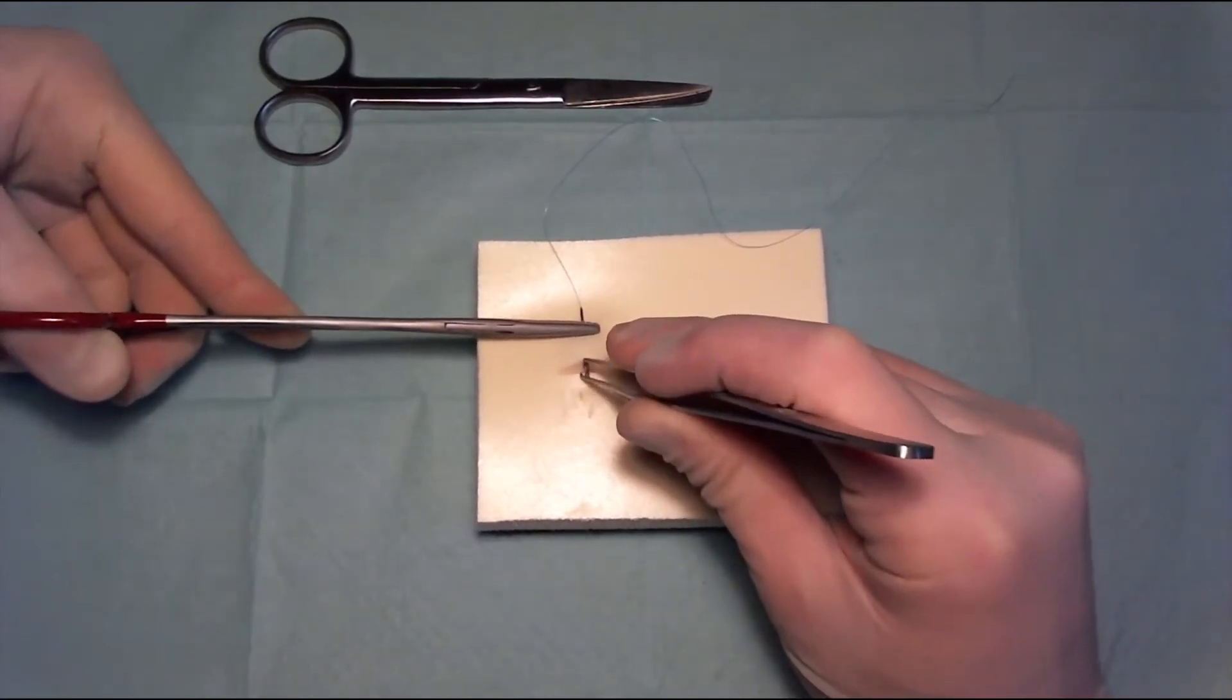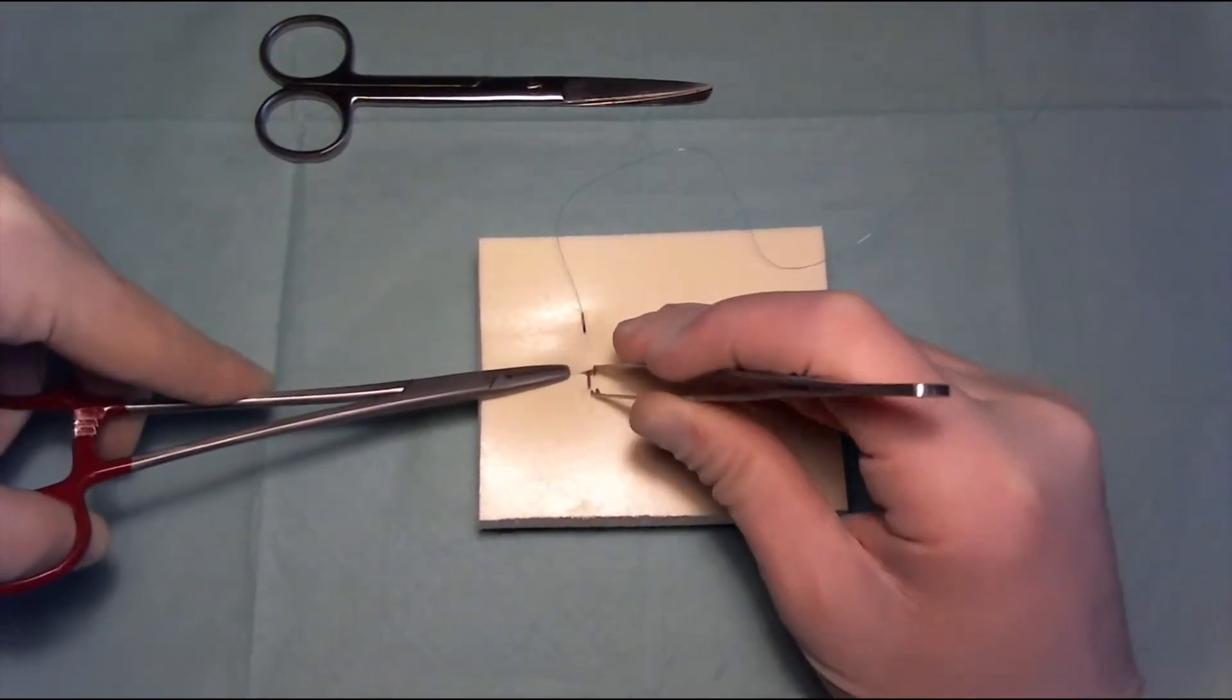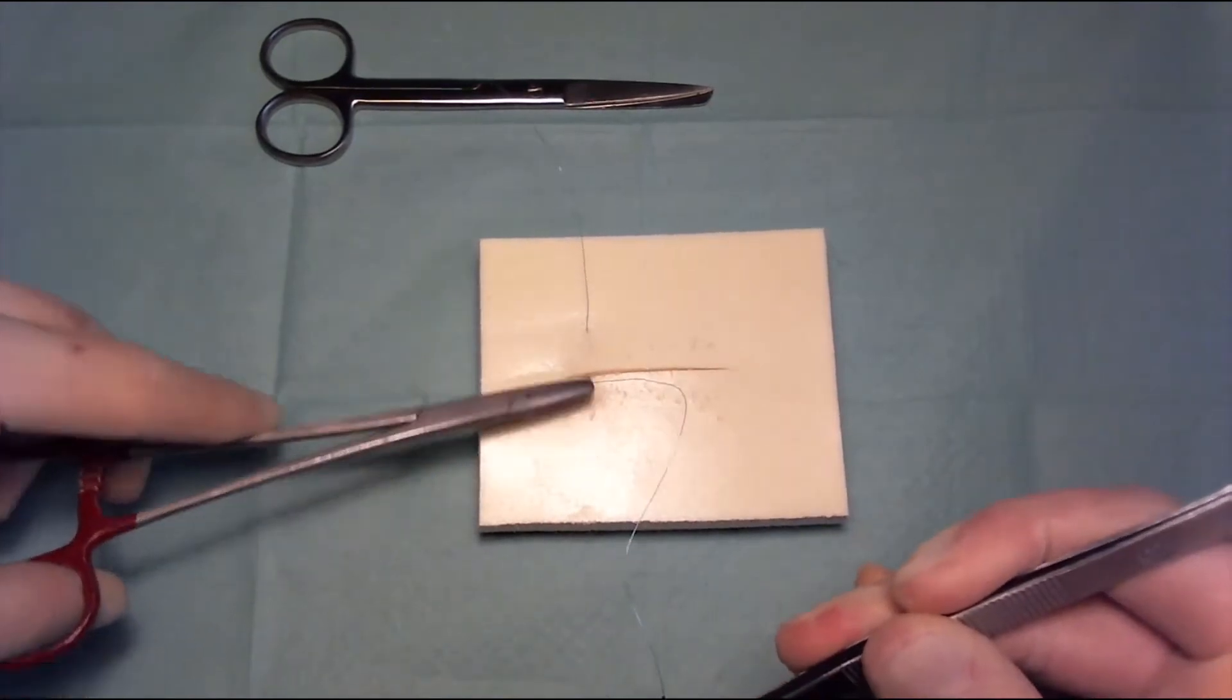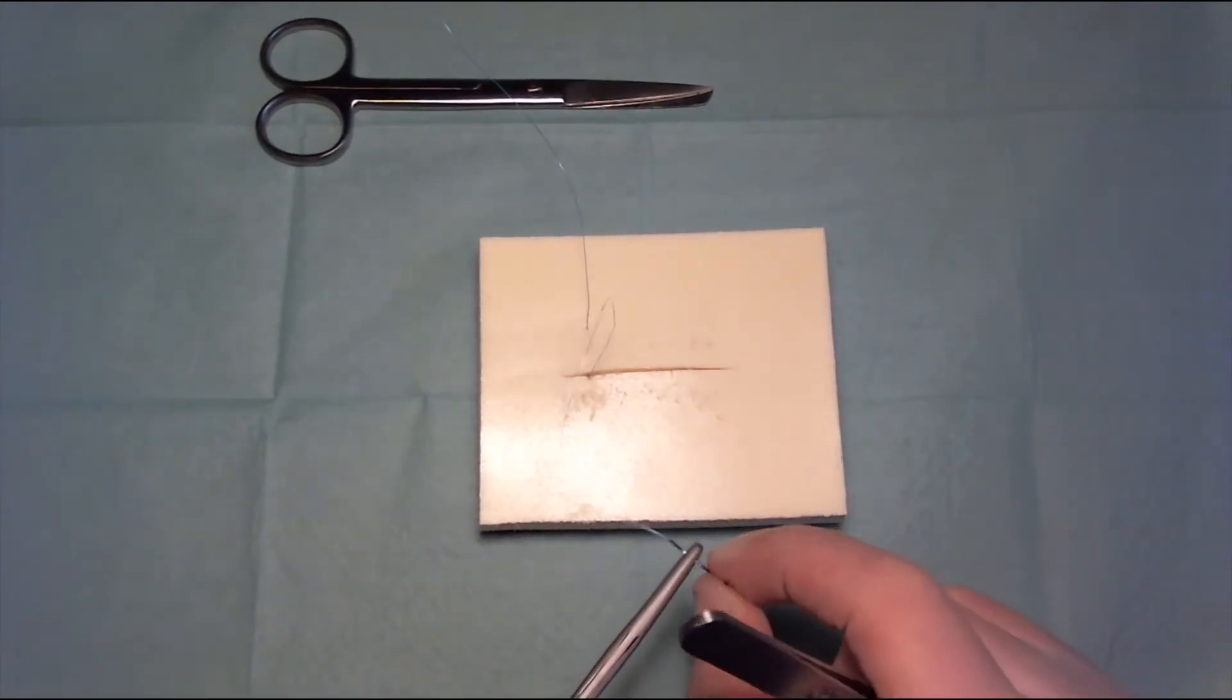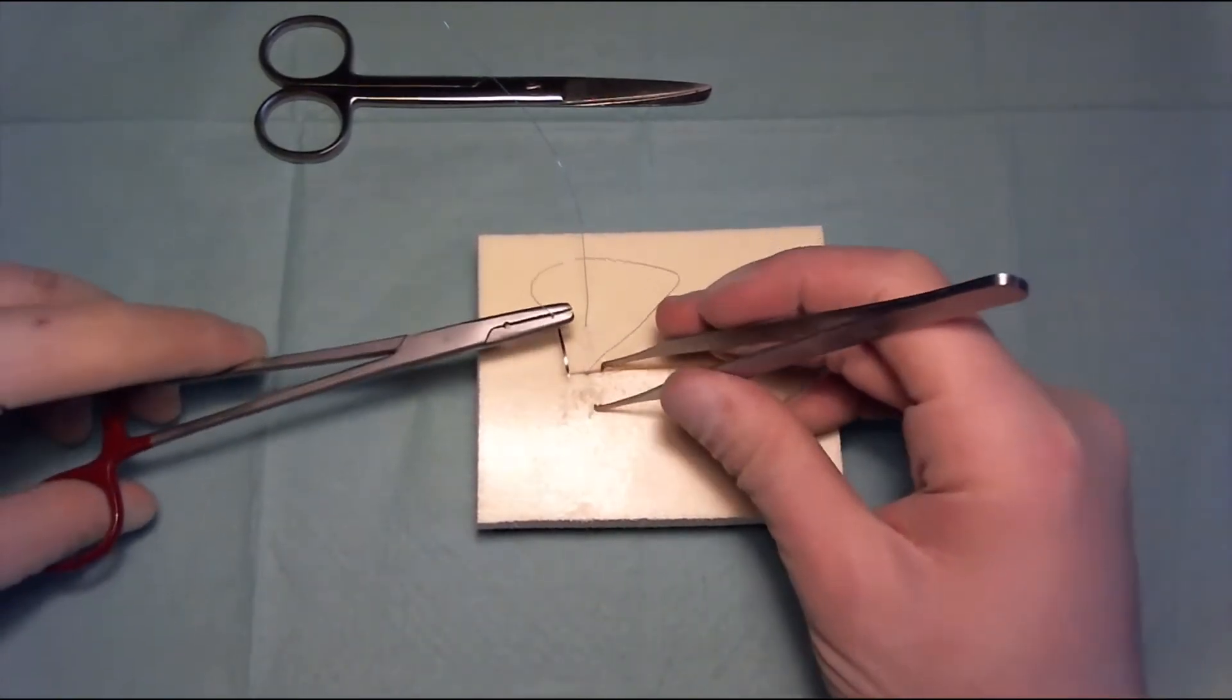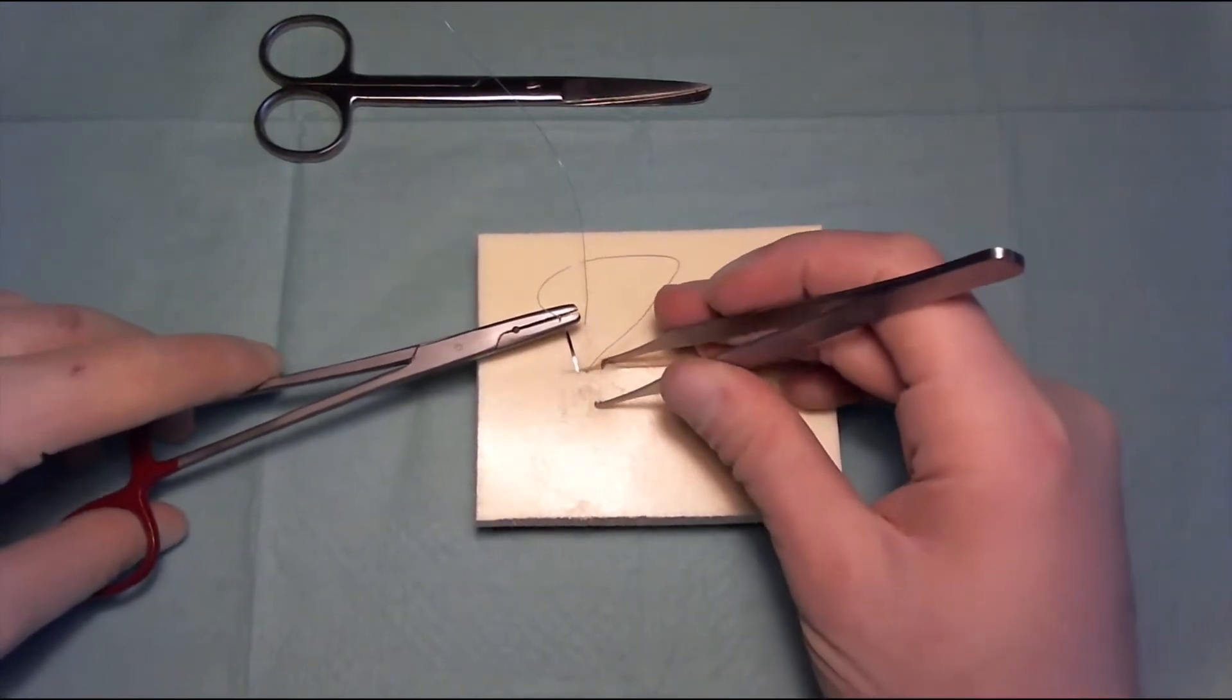Take the needle through. It's important to have some more distance because we're going to go back on our tracks, and you'll see what will happen in just a bit and why it's important to have that kind of distance. Now we're going to go out at the same distance.